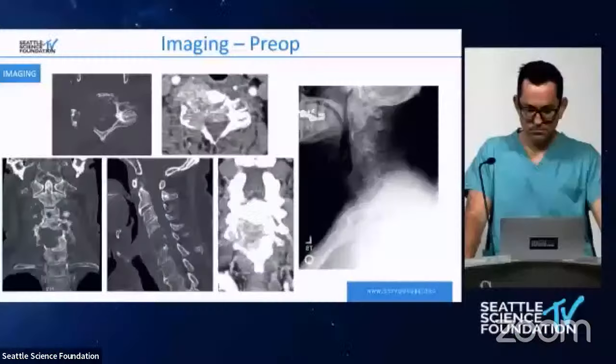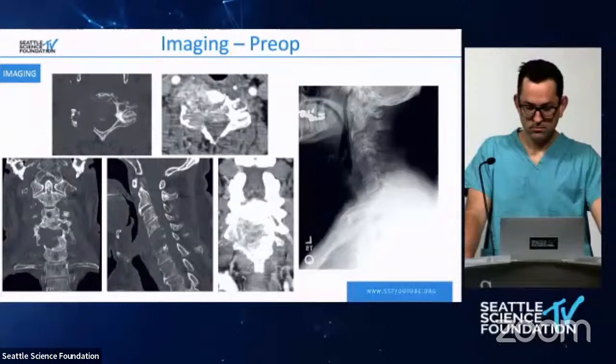That's my thought. And there's some lateral mass involvement from the right side, so you can actually dissect out part of the vertebral artery from the backside, as you show on that CT. Those are my thoughts.